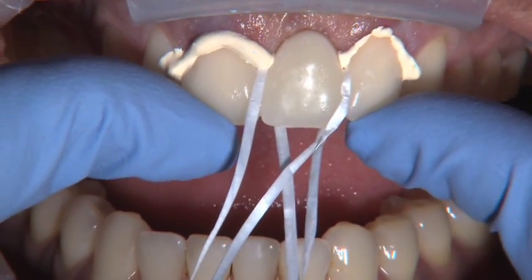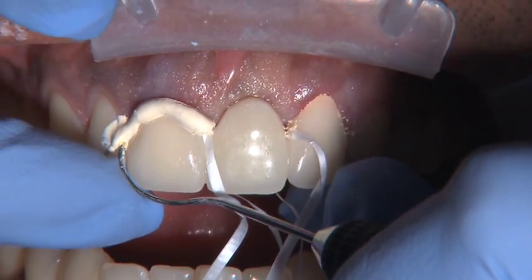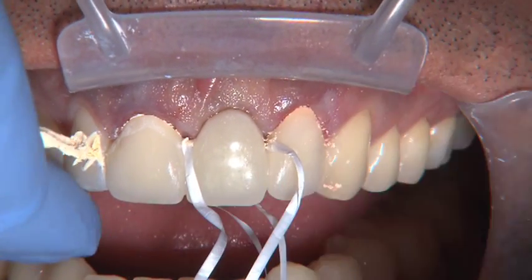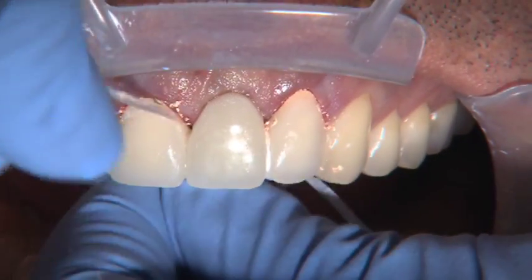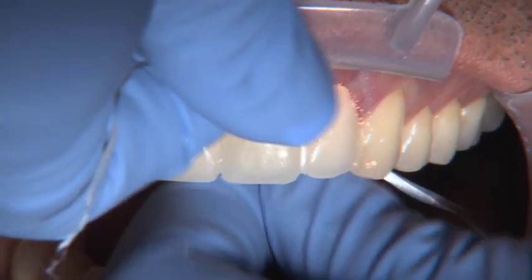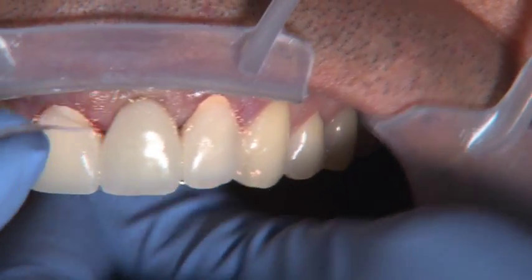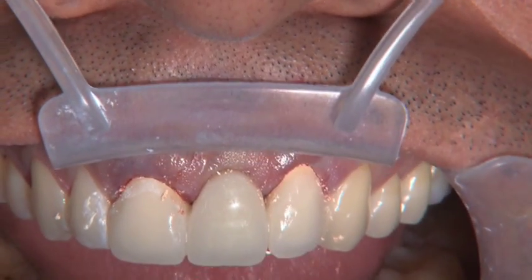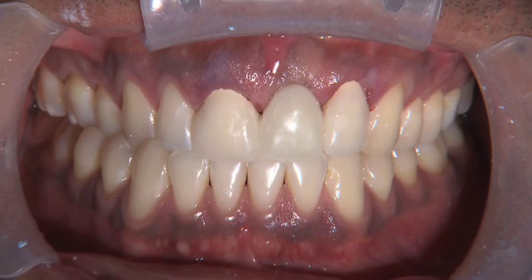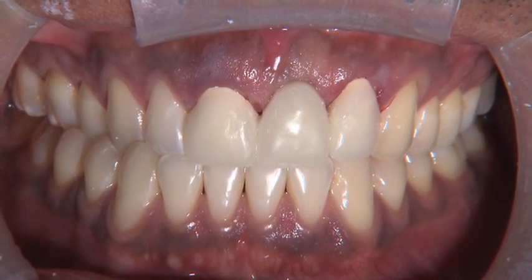We'll pass that information along with the digital color photograph to the technician to show them what we're shooting for. My assistant is going to cement the BioTemps Bridge with a couple pieces of floss underneath it. You do this because it's really important to make sure you get all those little pieces of cement out of that ovate ponic receptor site. We need to make sure the floss goes underneath there during the couple weeks of healing, so we cement the bridge with the floss already in place. You can use SuperFloss too if you want.